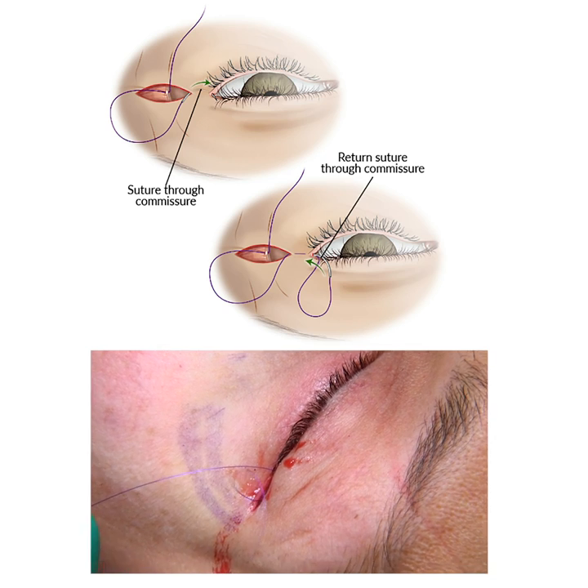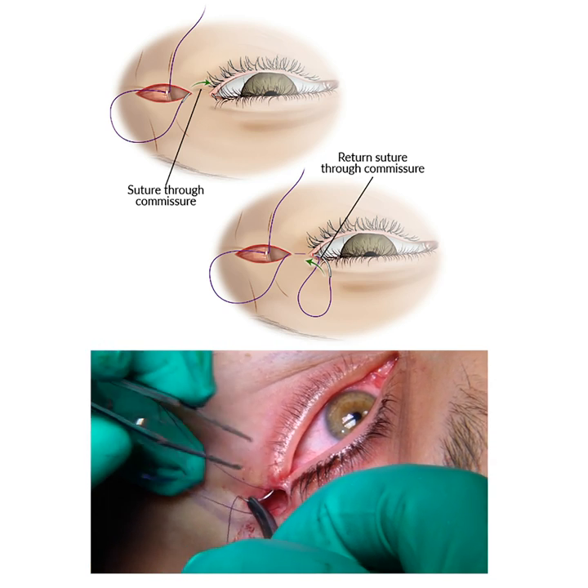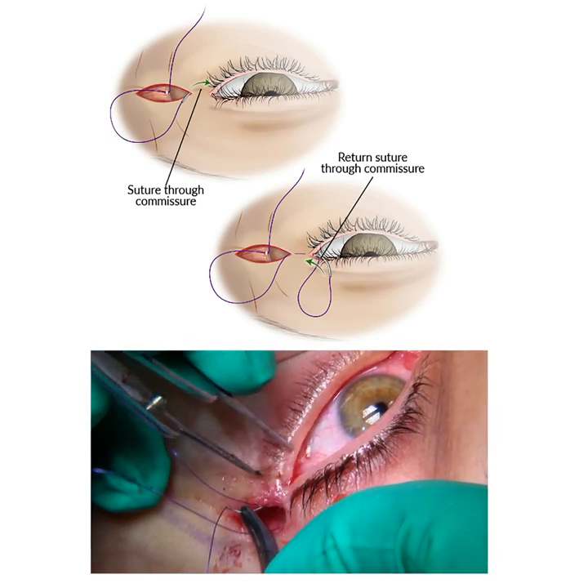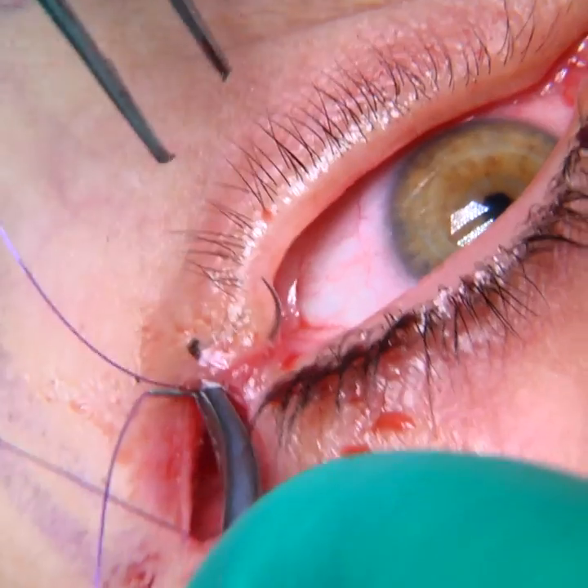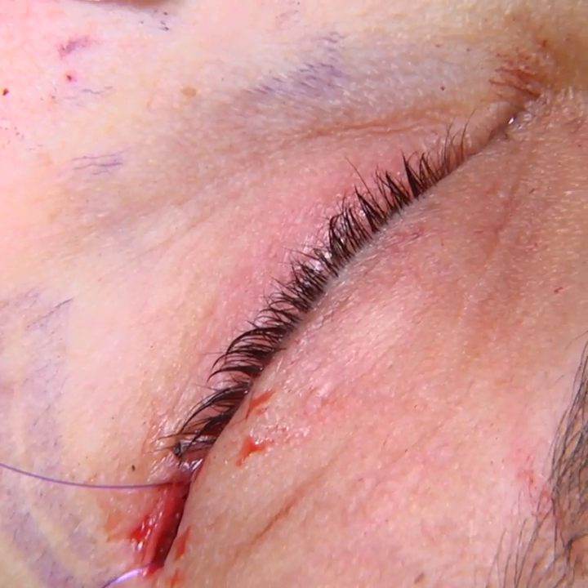And then we'll go to and fro through the commissure. Now we'll take another bite.